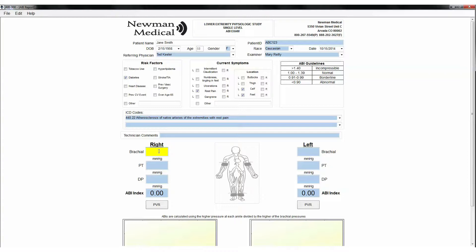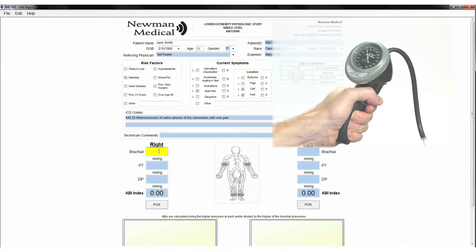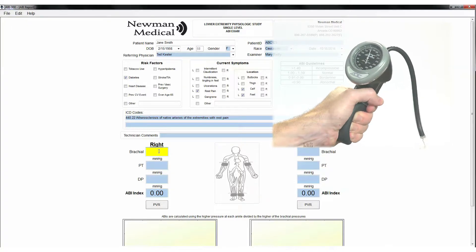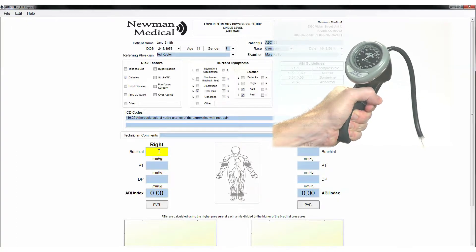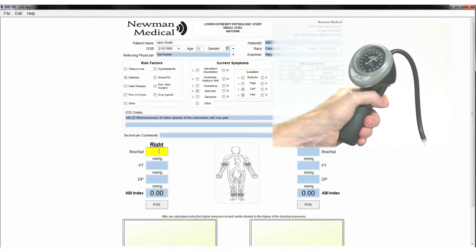Use the computer cursor and click on the right brachial field. Place the Doppler probe at a 45-degree angle to the skin over the radial artery. Move the probe slowly back and forth until the strongest arterial signal is heard. While listening to the arterial blood flow, inflate the cuff with the aneroid until you no longer hear the signal and continue for an additional 20 mm.